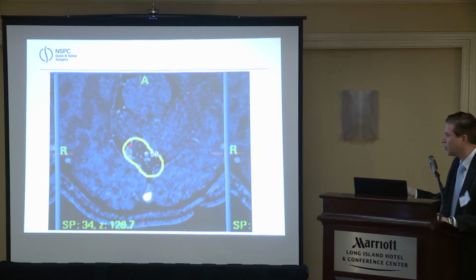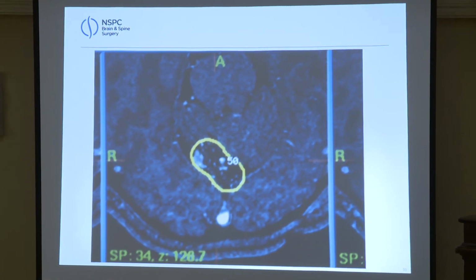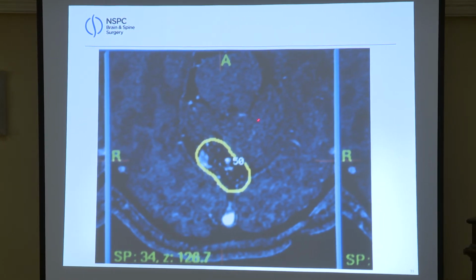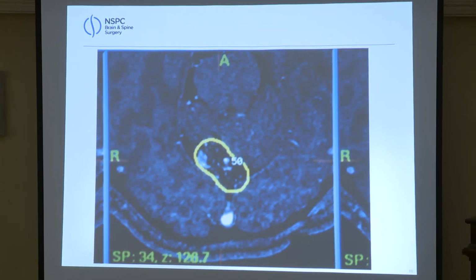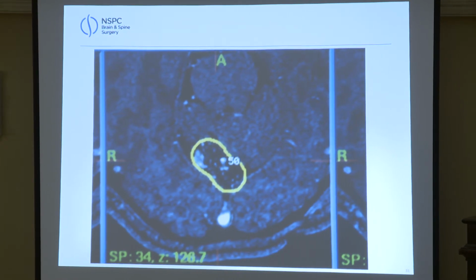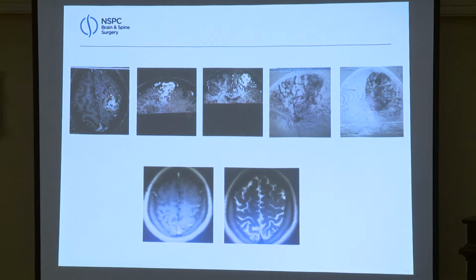There's a lady we did treat, she had ruptured her AVM when she was pregnant. We let her deliver, and then we did a Gamma Knife. Again, a very irregular looking AVM in the vermis of the cerebellum. And again, this is just to show you that we're able to contour exactly to the nidus, exactly to what we want to treat. This is one of my cases also.